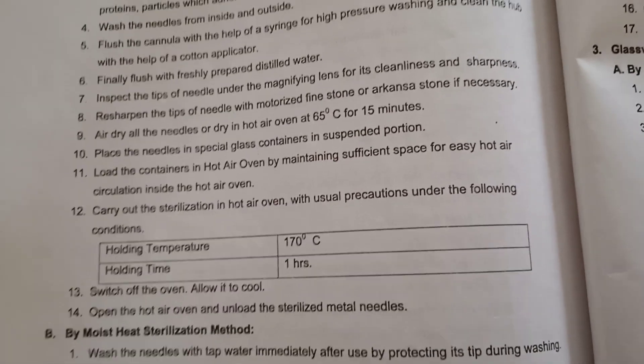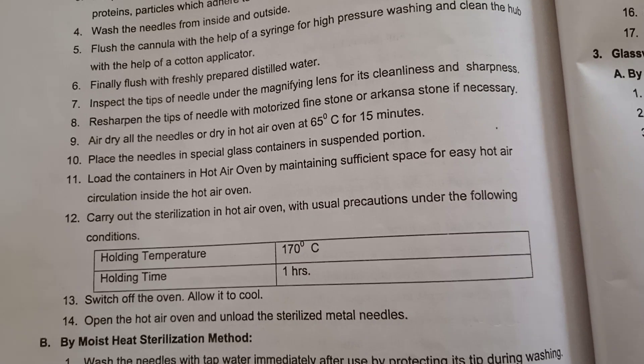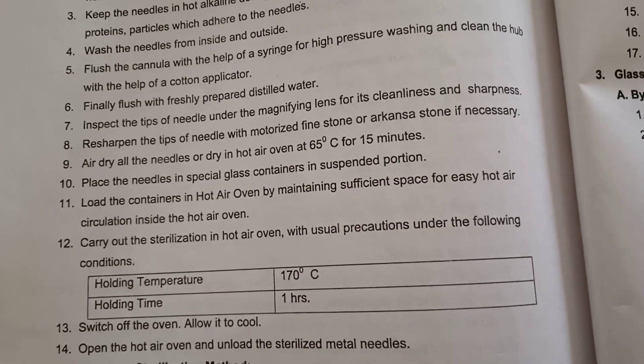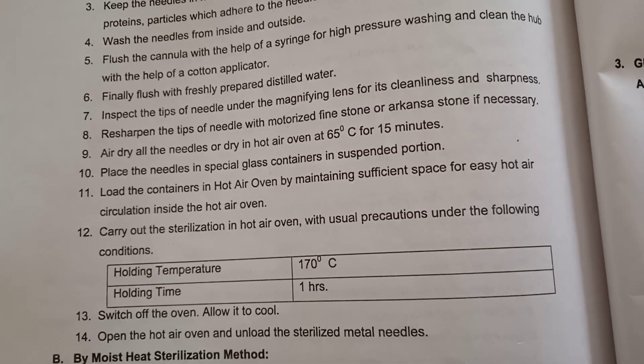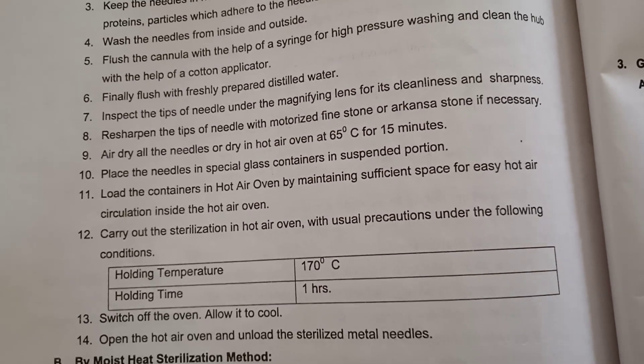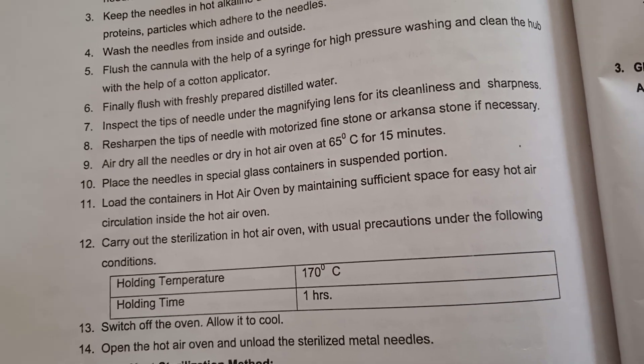These needles and syringes are opened only when you want to use them or when you want to administer any injection to the patient. That time only you can open the packing of these syringes and needles.